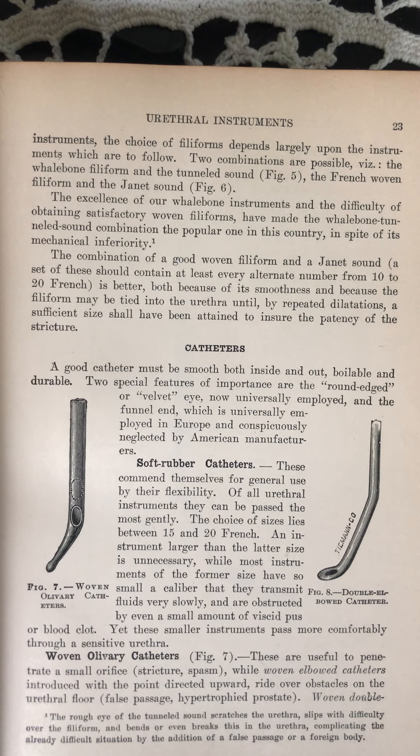Footnote: The rough eye of the tunneled sound scratches the urethra, slips with difficulty over the filiform, and bends or even breaks it in the urethra, complicating the already difficult situation by the addition of a false passage or a foreign body. The combination of a good woven filiform and a Janet sound — a set of these should contain at least every alternate number from 10 to 20 French — is better, both because of its smoothness and because the filiform may be tied into the urethra until, by repeated dilatations, a sufficient size shall have been attained to ensure the patency of the stricture.